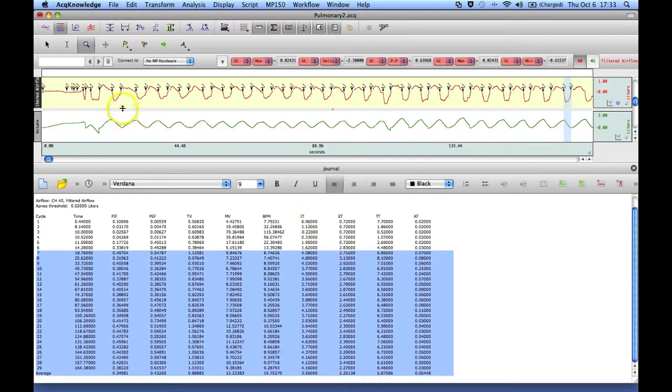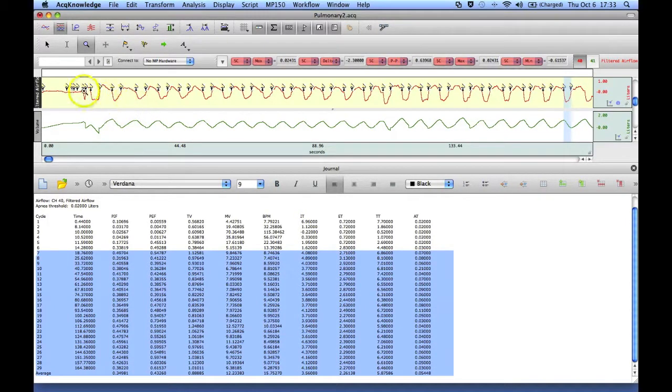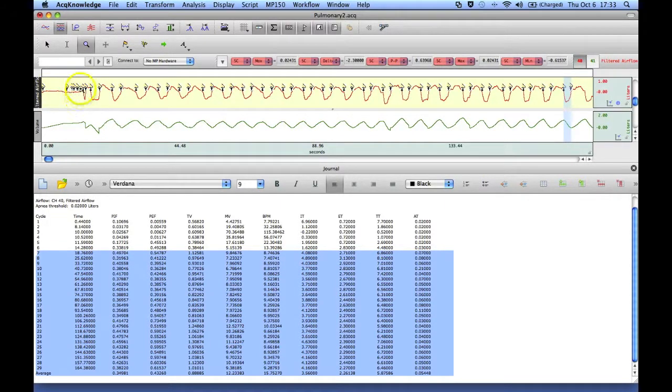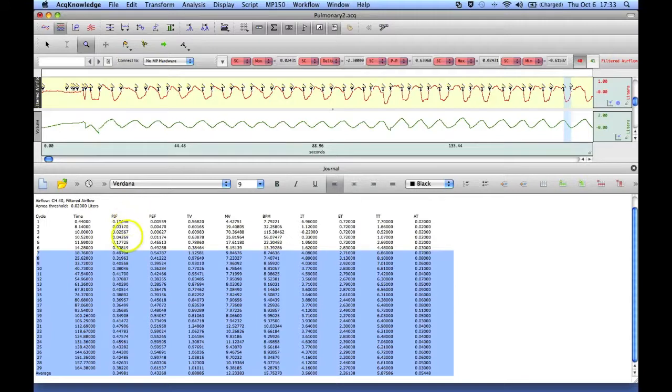Now if we were to do this with a real recording, we would want to delete these out of here because they don't represent valid cycles.